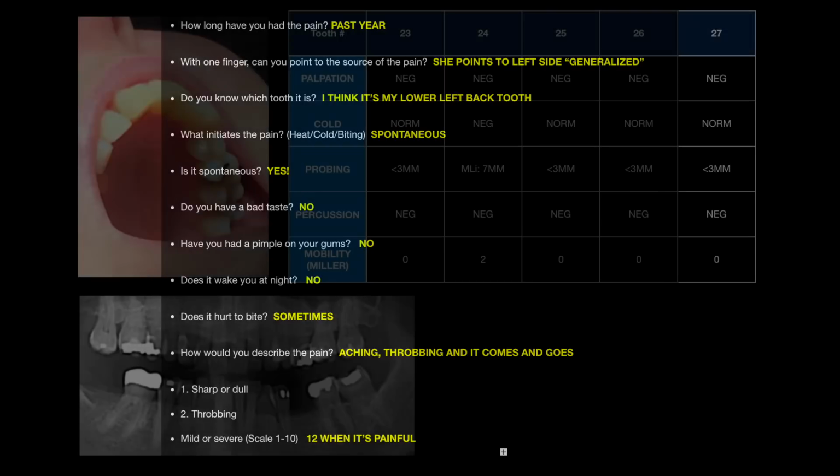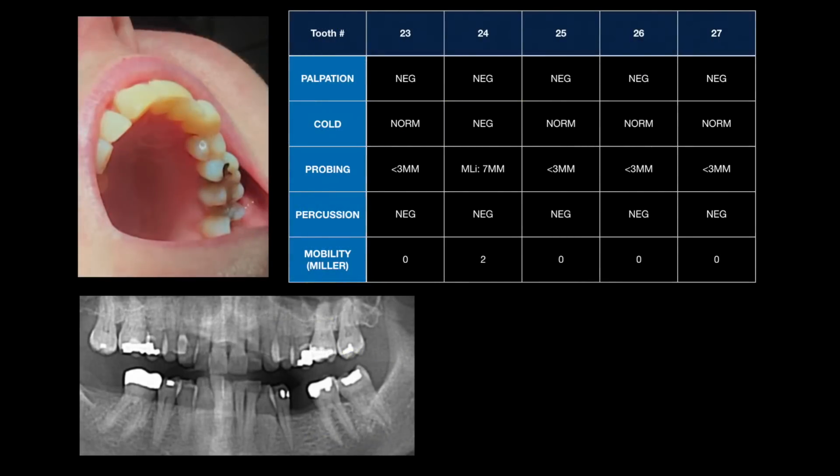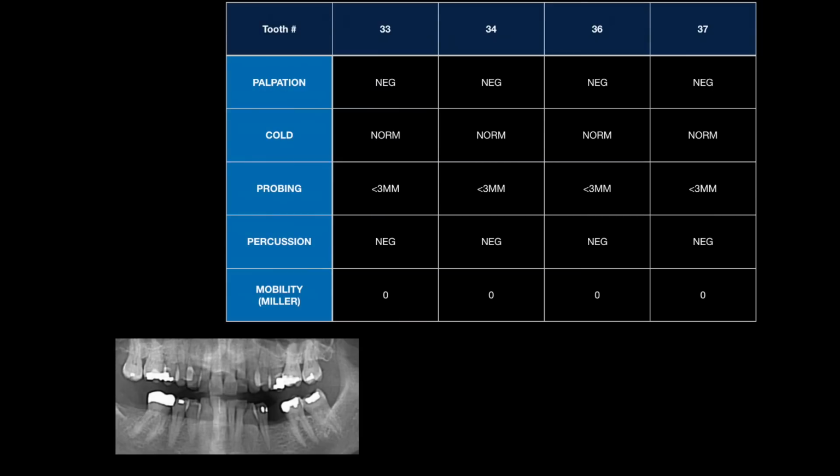The next image is an overview of the sensibility testing that I did. It's interesting that when I initially did the maxillary left quadrant and the mandibular left quadrant, all the testing, tooth number 24 came up negative on the cold, and I couldn't understand it until I did the percussion. And when it came out with that sound, I couldn't believe it. I almost fell off my chair because it was just this really interesting sound.